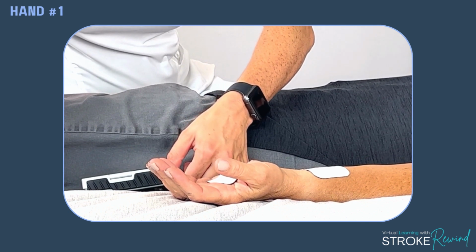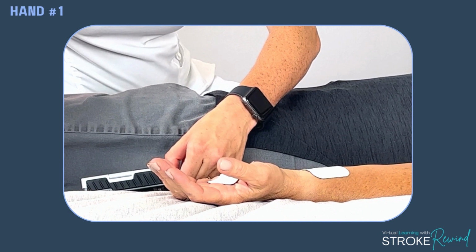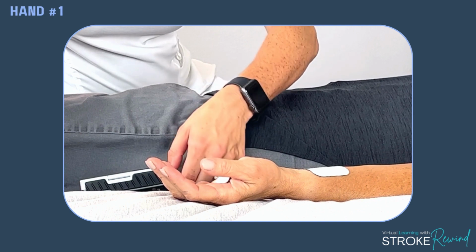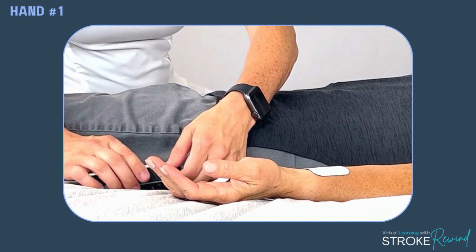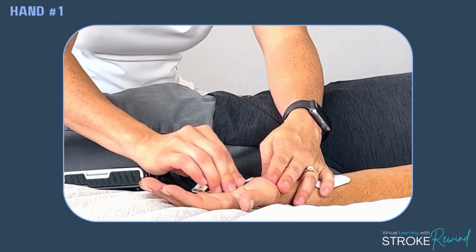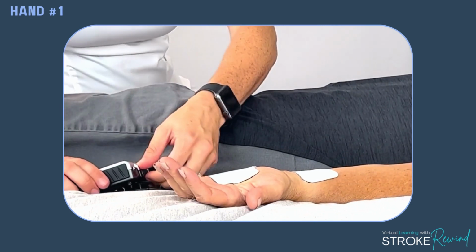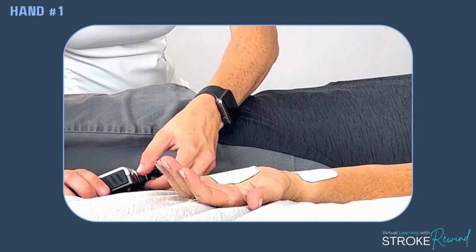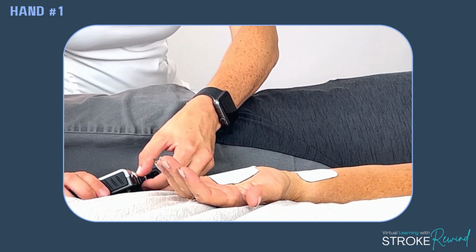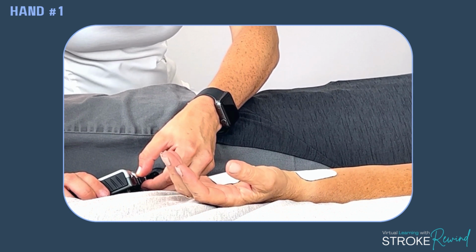Maybe we move that down a little bit. If I wanted it to move somewhere else, I would simply move the pad. See that thumb? It's kind of heavy placed over here. I can show you one more placement. You can take it and put it out towards the pinky side. You can move this maybe up a little more. Let's try this one. Turning it on. Let me know when you can feel it. I can feel it. Okay. See how we're getting a little bit more movement in a different way, a little bit more pinky.